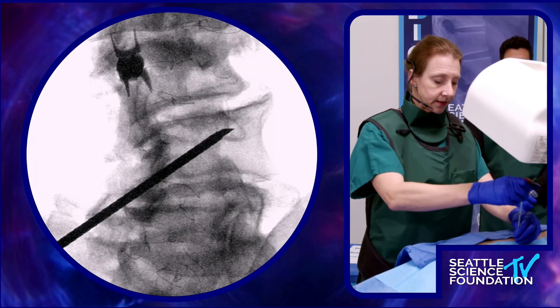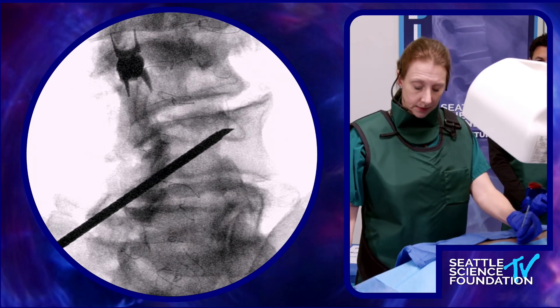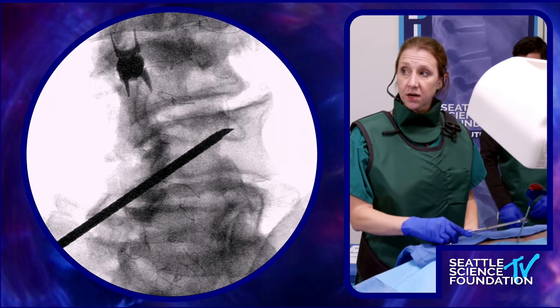The idea here is to come lateral to dock this introducer.